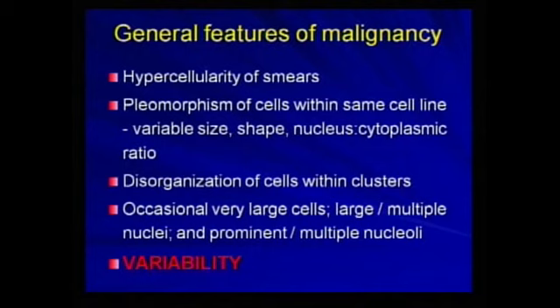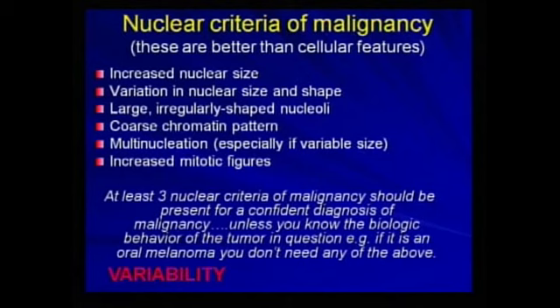And there's one other feature that we will see later on, a feature called nuclear molding, which I have had a lot of trouble with over the years. And then finally someone explained it to me in very simple terms, and I think I have a good handle on it now. And we'll talk about that shortly.